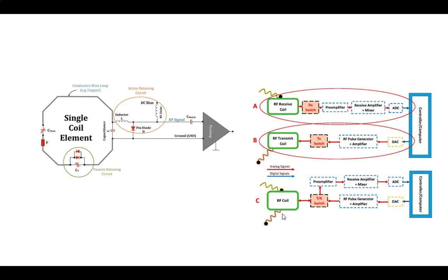So you can tune this one to pick up a particular spatial region better. Again, I want this coil to be resonant with the area that's spinning. Just like the kick had to be resonant to cause it, this one needs to be resonant to get a good readout. So that's primarily done here, right?